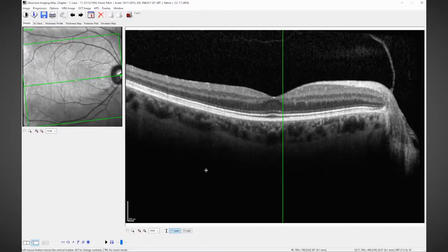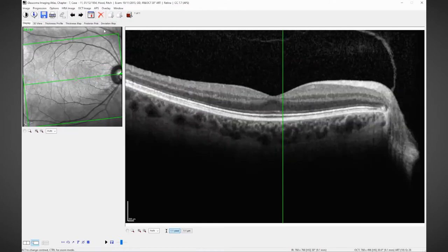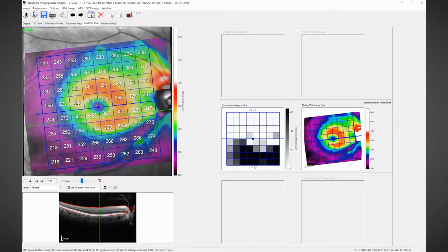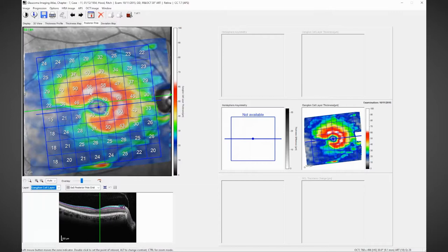Finally we move to the macular area and we do a complete posterior pole scan where we can then segment all of the layers of the retina, particularly looking at the ganglion cell layer, where we're looking for notching of the ganglion cell layer across the horizontal midline and looking for imbalance or asymmetry between the upper and lower hemifields.